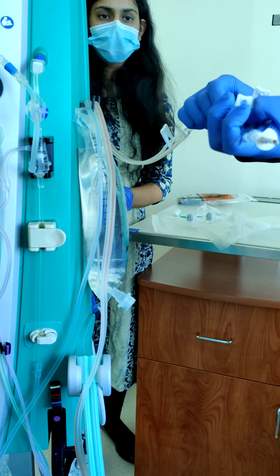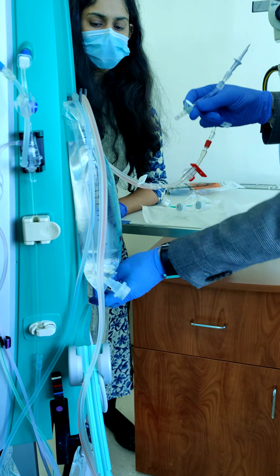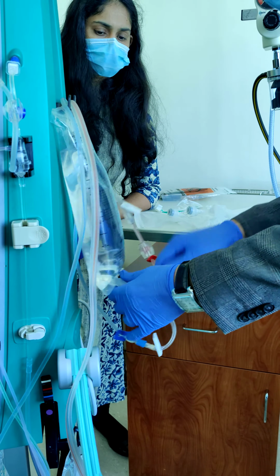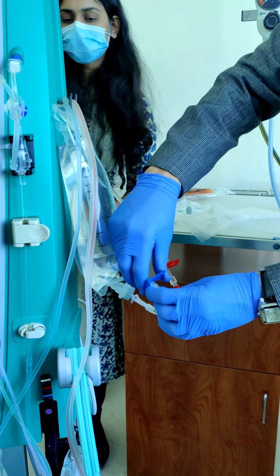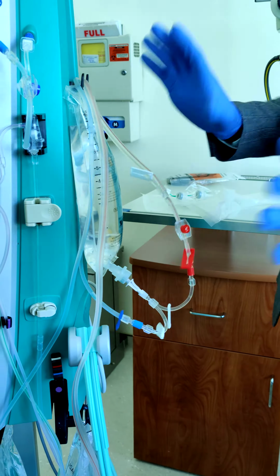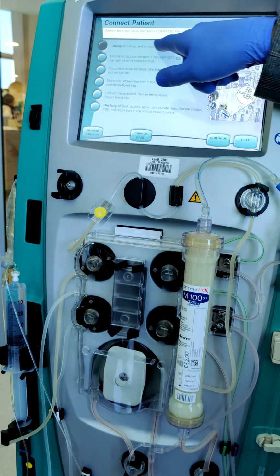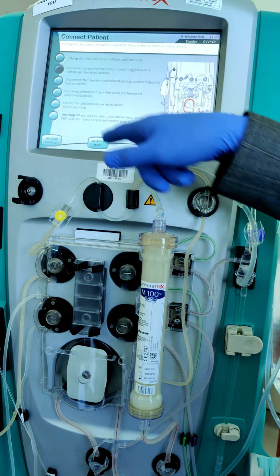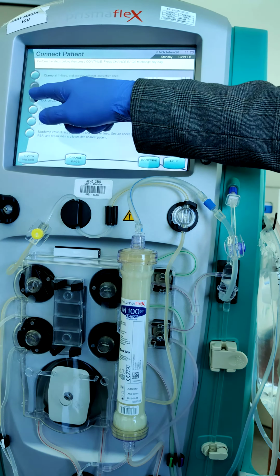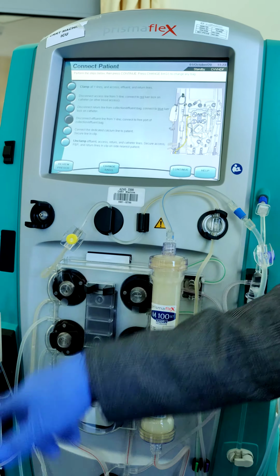I will use this one as the catheter of the patient, and we can assume this is our patient again. 1, 2, 3, 4, 5, 6, that remains the same. Here clamp all the lines, it means 6 clamps. Disconnect the access line connected with the patient. Disconnect the blue return line connected with the patient. Disconnect the yellow effluent line connected with the effluent bag.